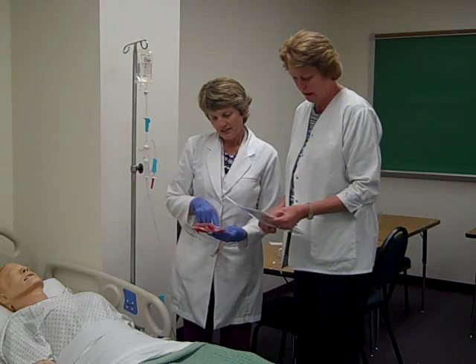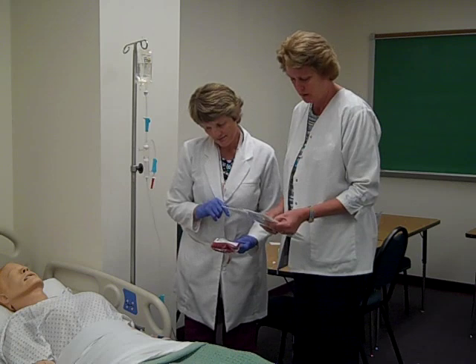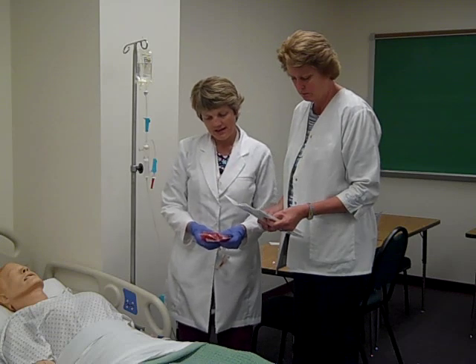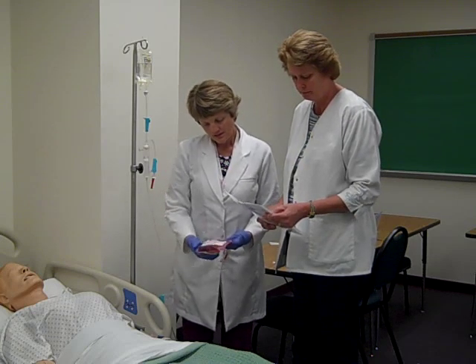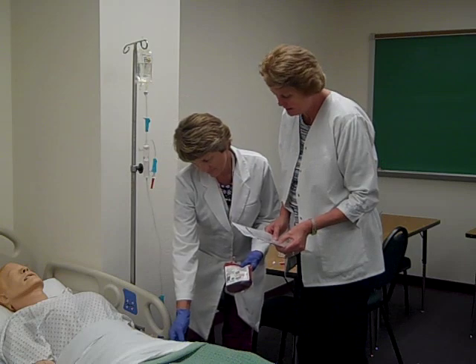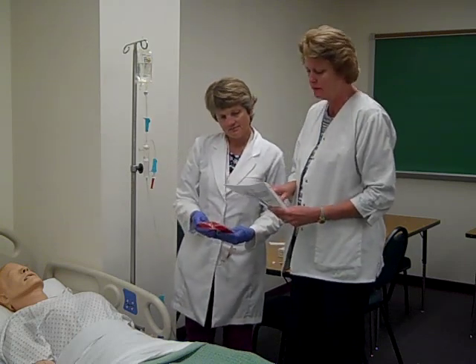And the blood type is AB, RH positive. And the donor unit number is 0016157. And the blood band number is ABC987. Okay, and it expires 10/15/10.